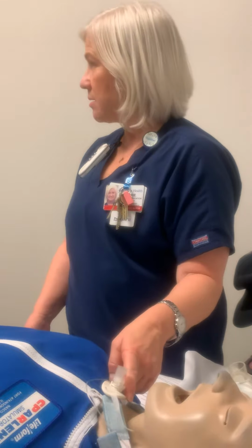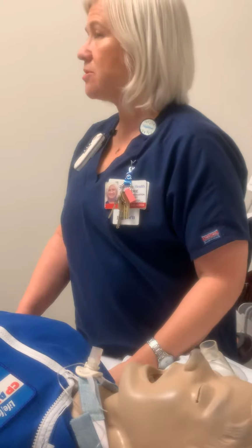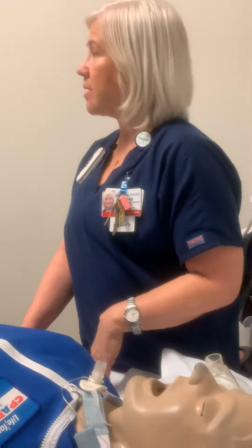But then the other one is your partial laryngectomy, which a lot of times they're going to have a trach tube in. Okay, so don't look at this and assume it's a tracheostomy because it could be a laryngectomy with a temporary trach. And I know Dr. Tomei here will a lot of times when he does his laryngectomy, he'll put a temporary trach in and they even go home with it and they may pop back in too. So you may see them here too.